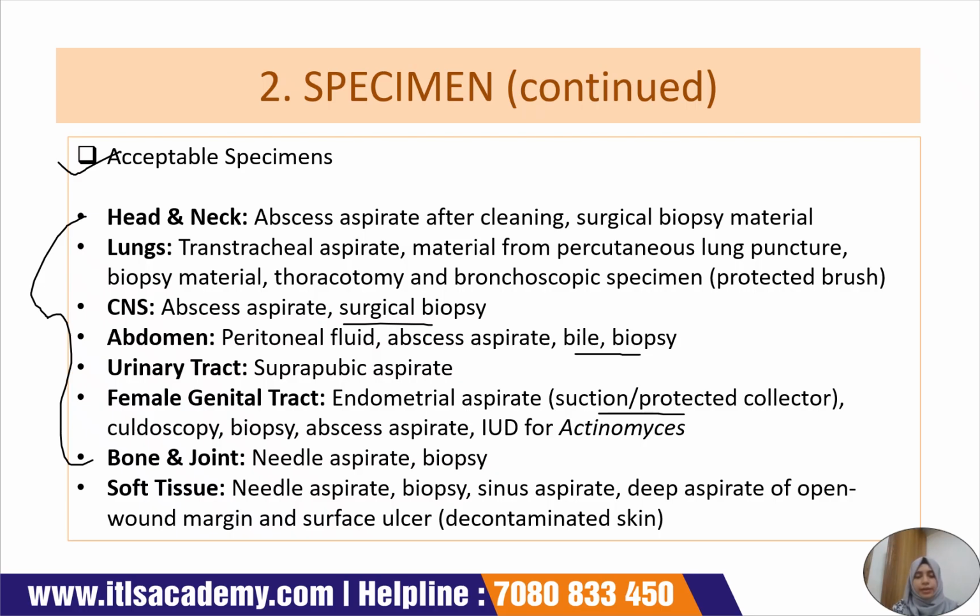From bone and joints, aspirates are considered best, but they should be taken via needle, and biopsy materials. From soft tissues, aspirates must be taken by needle, biopsy materials are taken, sinus aspirates are taken. Deep aspirates from wound margins and surface ulcers are also considered best for anaerobic recovery, but these must be taken via decontaminated skin.